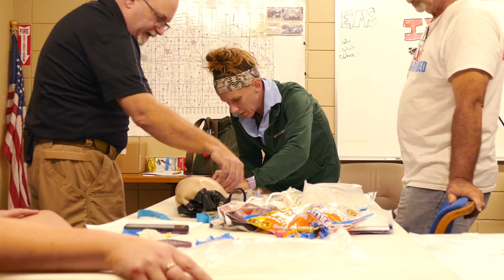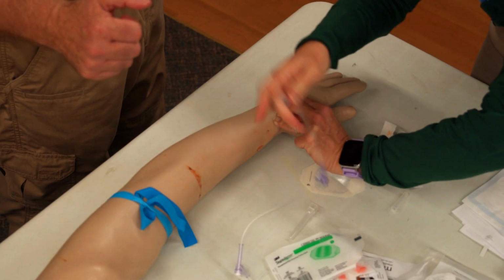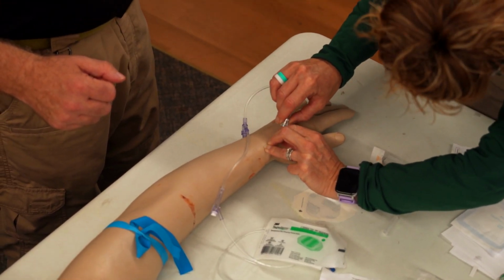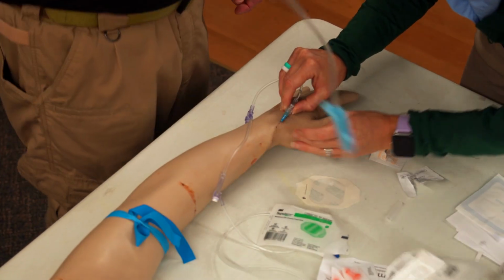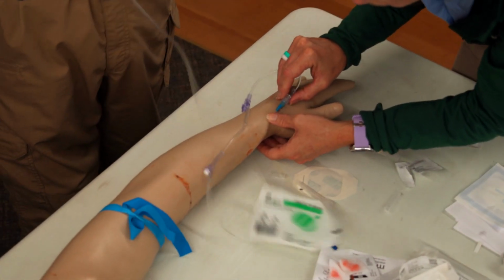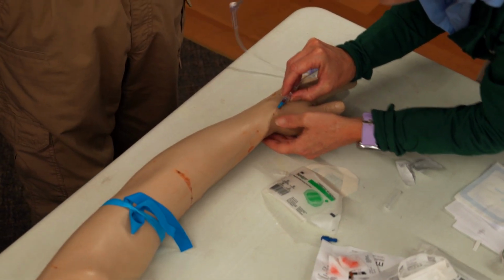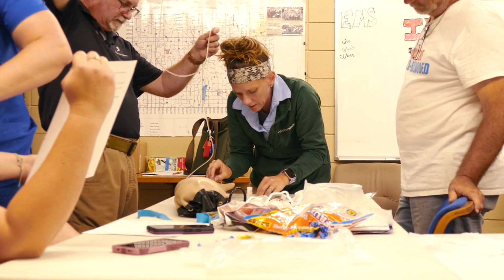So you're tamponading that off, and I'm going to let you do everything. Oops, now you touched the end. Doesn't matter, your gloves aren't sterile. Okay. There you go. Okay, so you're in. Put it in your hand. Oh, but it's not really straight, right? I think you're in. Now you're gonna pull tension and hold it. Okay. Pull tension and hold it.